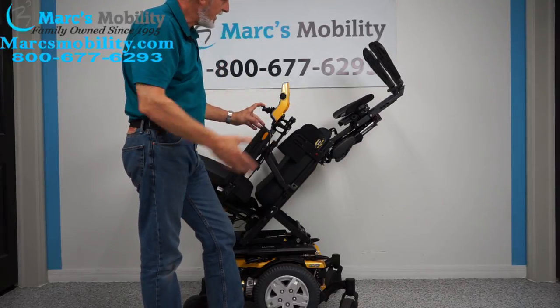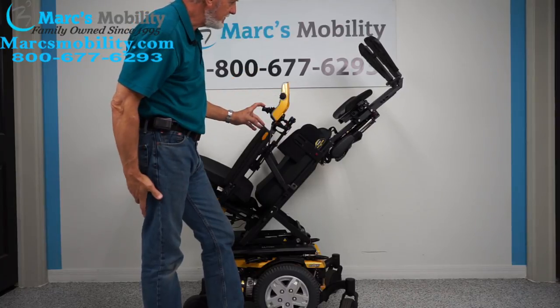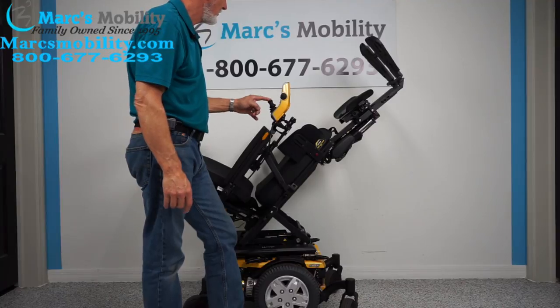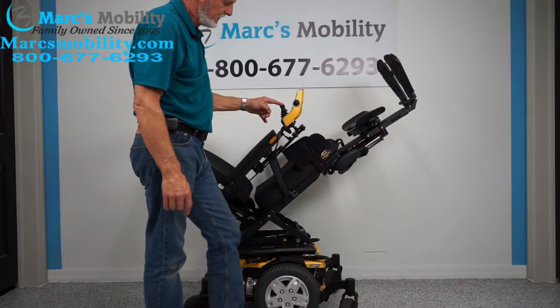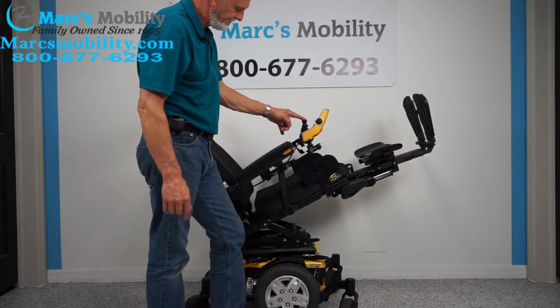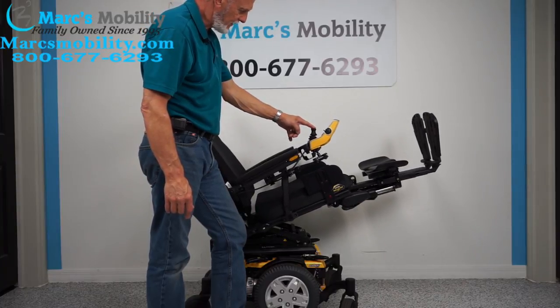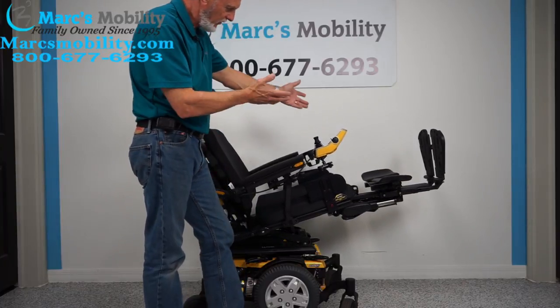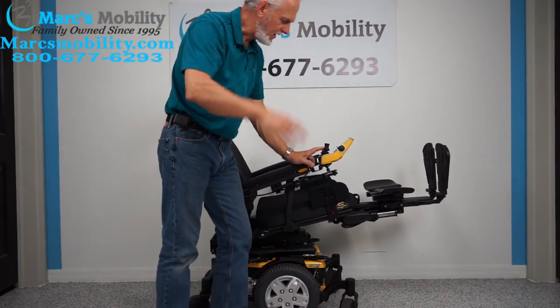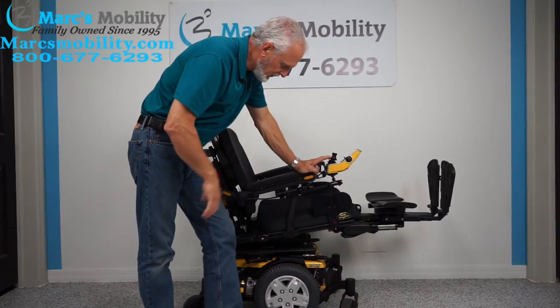If you need good circulation — this would be a little extreme — but if you're halfway tilted and bring the seat down halfway, your feet are still higher than your body. So you don't have to go all the way up unless you want to.